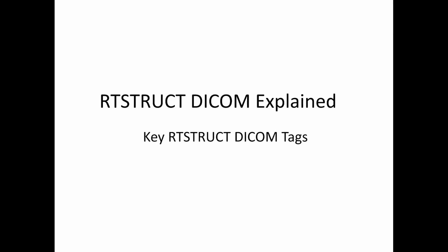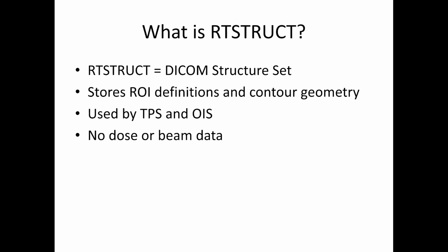Today, we'll walk through the most important DICOM tags used in RTSTRUCT files. Understanding these few tags will help you quickly debug contour import issues and build reliable DICOM-based tools. Let's get started.